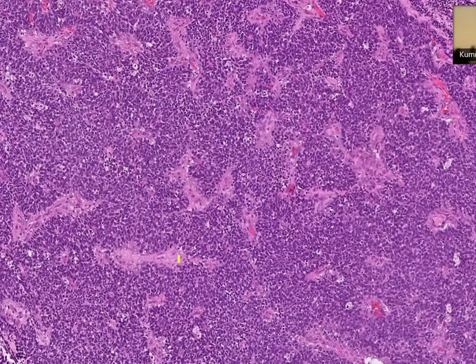It shows a highly cellular tumor, densely packed tumor cells with few hypocellular areas. Where are the hypocellular areas? These are blood vessels. But I thought the hypocellular areas would be neuropil-like material. But where is it? At least in this power, you can say that the patchy hypocellular areas are predominantly comprised of blood vessels.